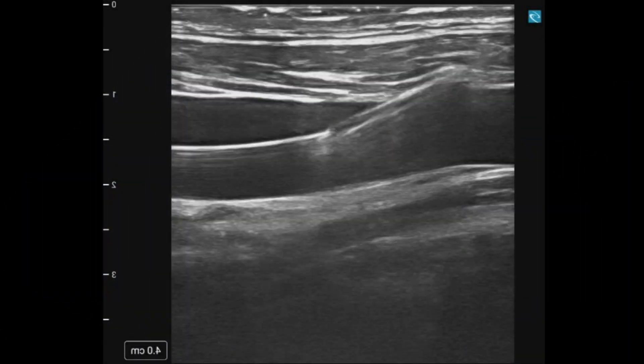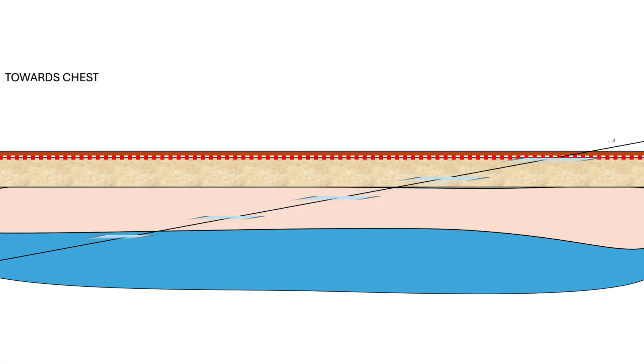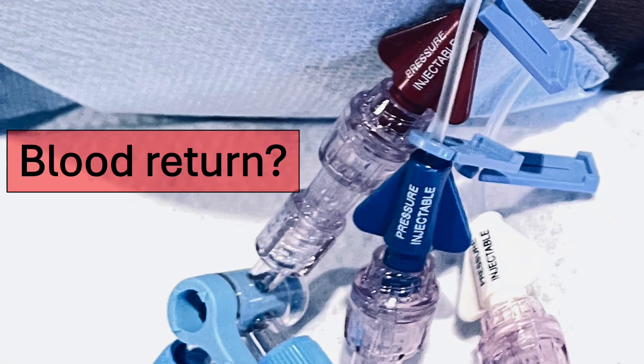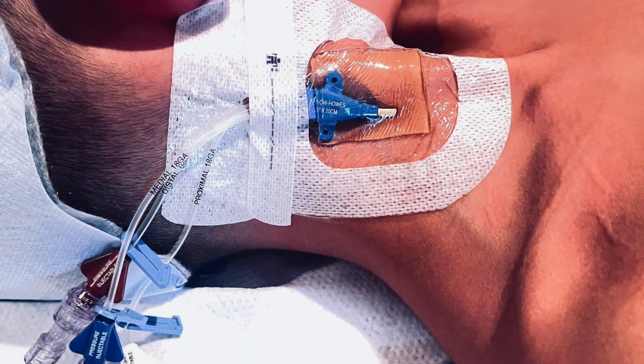I then remove the introducer needle over the wire and nick the skin and dilate over the wire. I remove the dilator and slide my catheter over the wire. I then remove the wire and ensure blood return through my ports. I stitch it down, clean, and apply a sterile dressing.